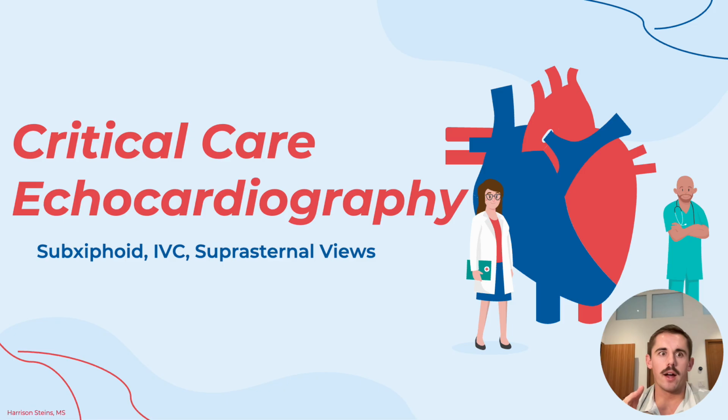So the subxiphoid view can facilitate rapid detection of something like a pericardial effusion and aid in estimating right atrial pressure and fluid responsiveness, though they must be interpreted in the clinical context, just as everything that we've talked about.